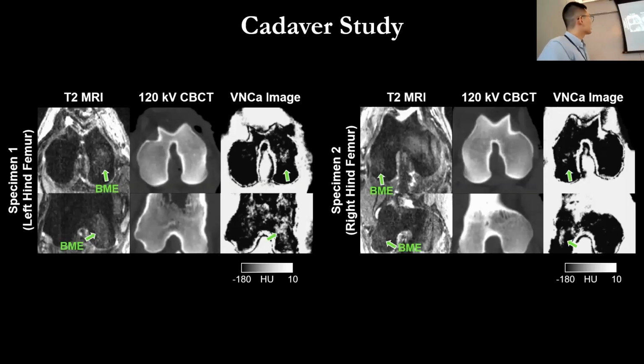And we can reconstruct this edema on the medial condyle for both of these cases, as you can see here. But the one issue that we're trying to deal with is that there are some false positive signals on the other condyle that's supposed to not have them. Especially in this case, the signal on the lateral condyle is supposed to be healthy. There's supposed to be no edema on this sheep's lateral condyle. So this is a false positive signal that we are working on.